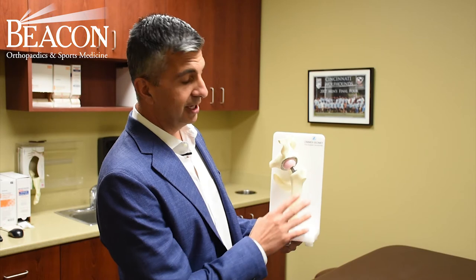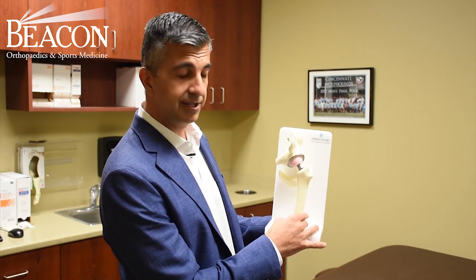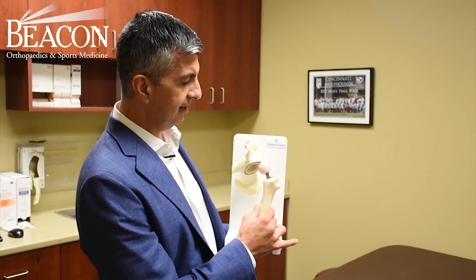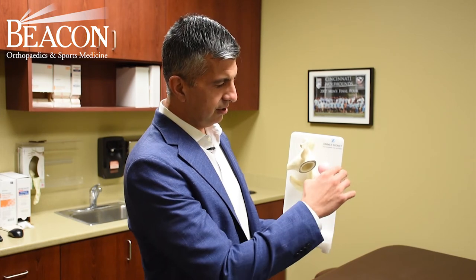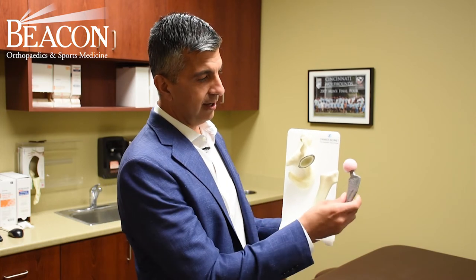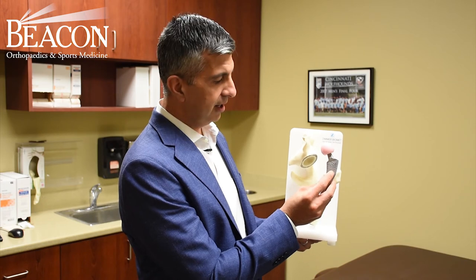We do the hip replacement through an anterior approach, so we don't have to cut any muscle or tendon. The femoral component and the acetabular component are fixed with what we call bone in-growth technology, so the implants themselves have a coating that the bone has affinity for, and there's no cement.